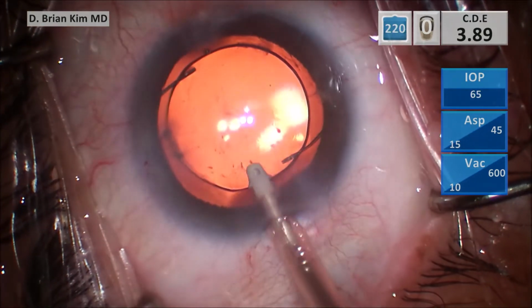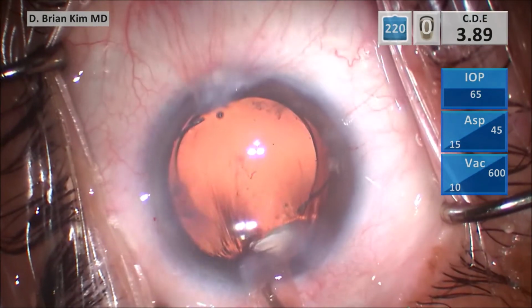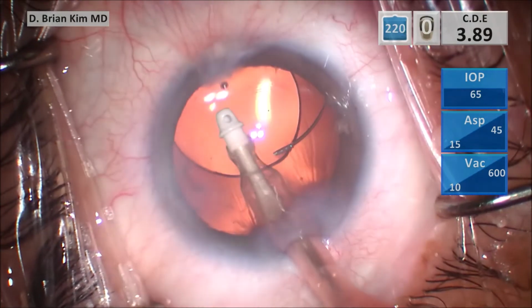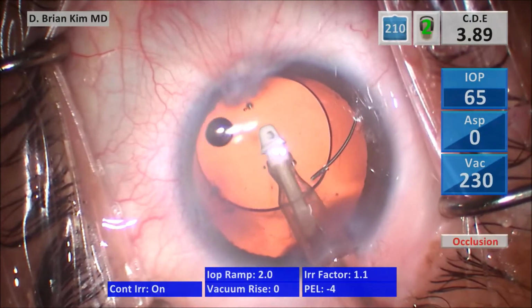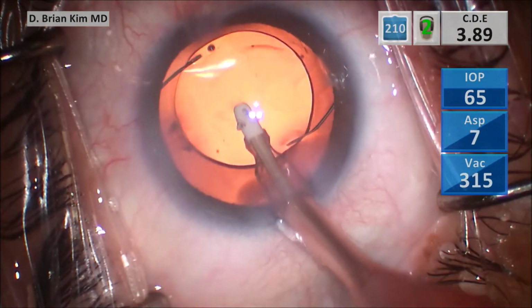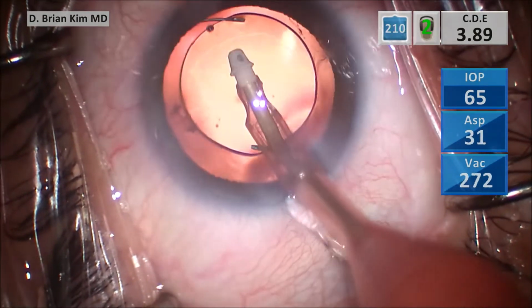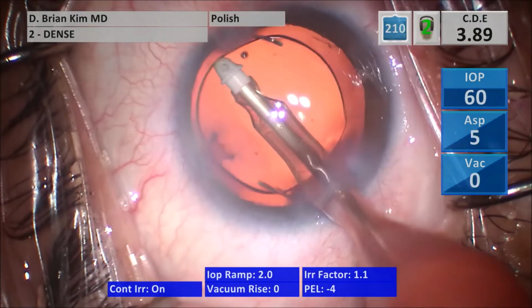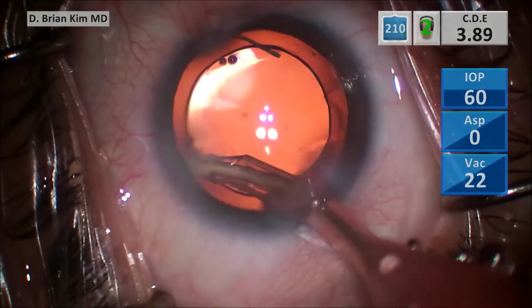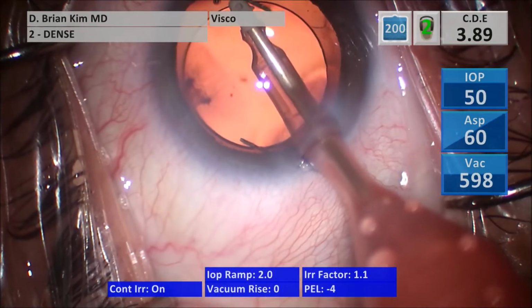Go in with irrigation off, activate irrigation. Going underneath the lens, removing all the viscoelastic from within the bag, repositioning the optic, switching to polish mode, polishing underneath the rhexis edge one more time to remove the lens epithelial cells, switch to visco mode, removing all the viscoelastic from the anterior chamber, and then I'll hydrate my incision.